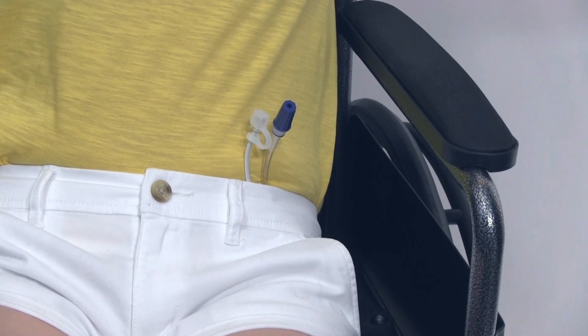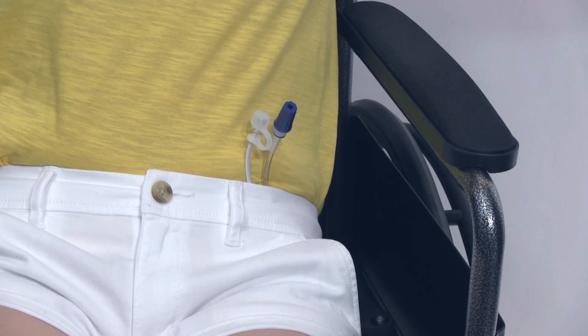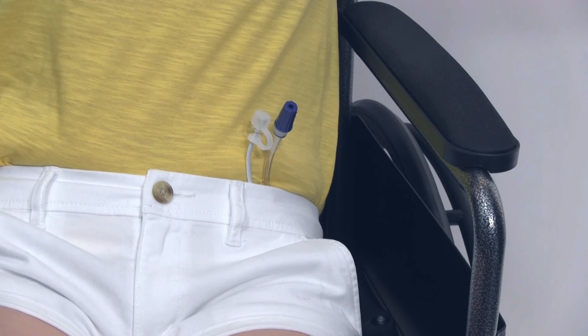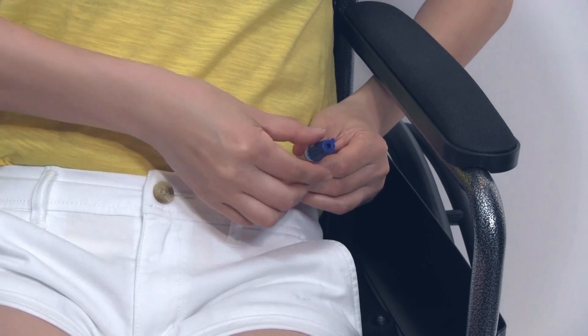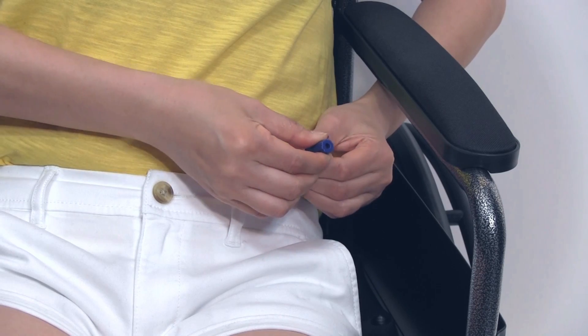After dressing, position the ends of the discharge tube and the controller cable in the waistband of your clothing. Please check again to ensure the end cap on the discharge tube is tight.